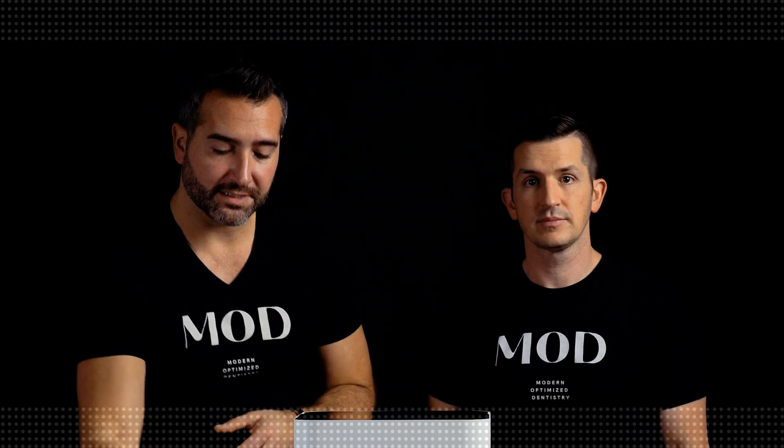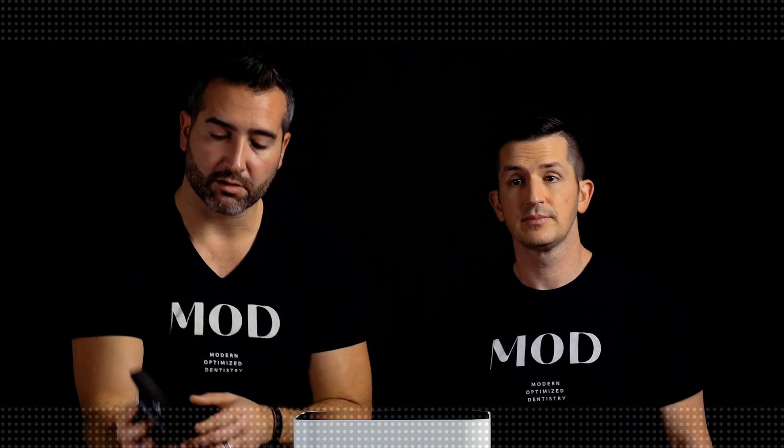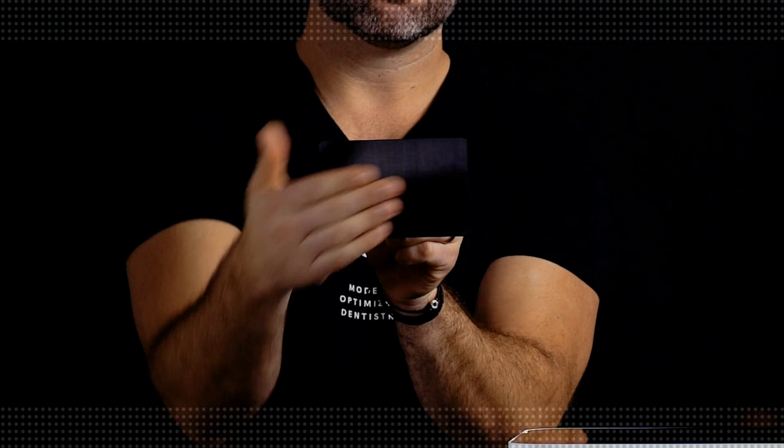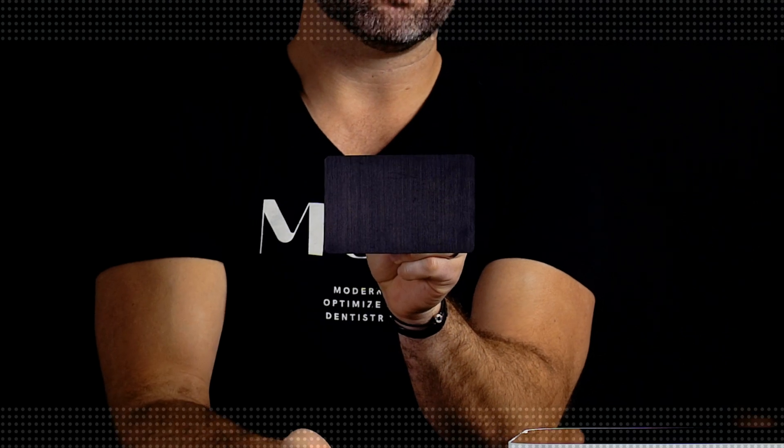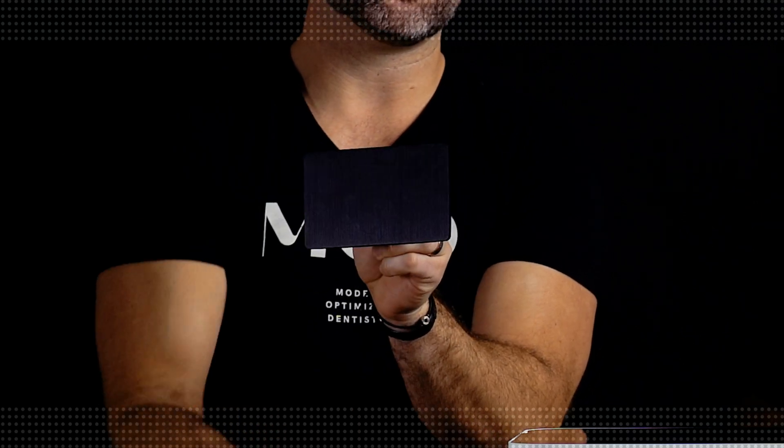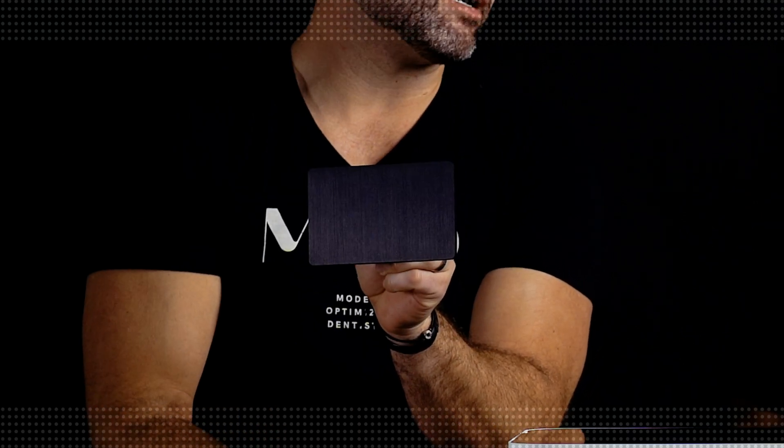Another thing is it doesn't have heat, so that's going to cause a lack of the ability to do fast printing on a larger vat. This is the largest build plate that you could get with the printer and it's still relatively small compared to some higher throughput printers.